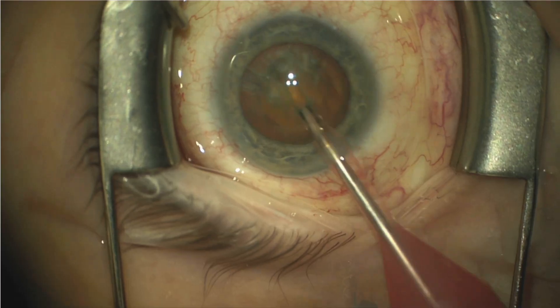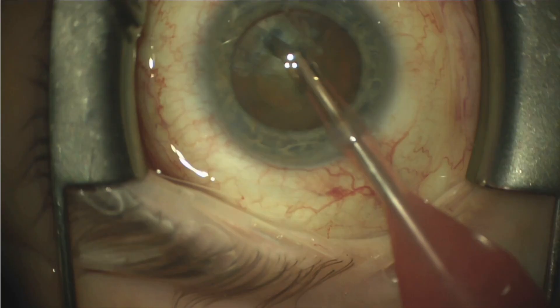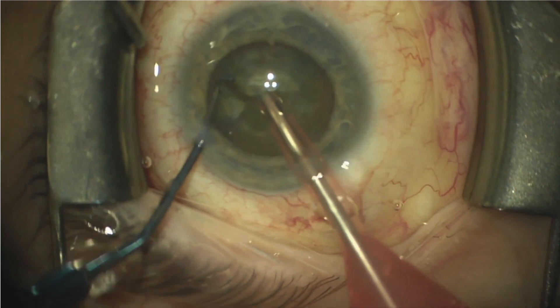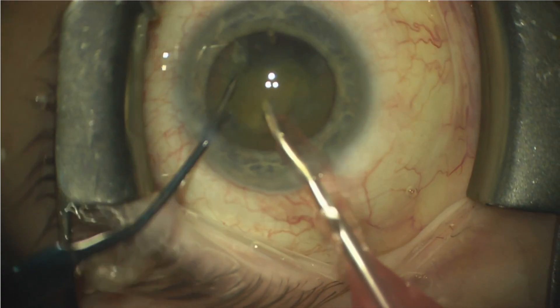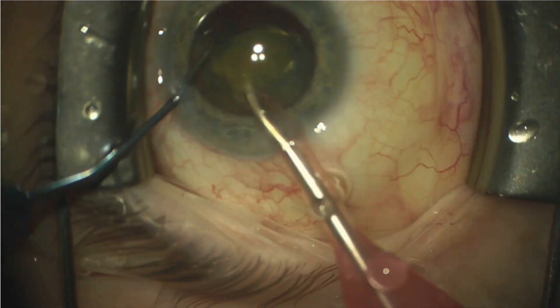This capsulorrhexis is about 3.5 to 4 mm in size. It's followed by hydrodissection and then a divide-and-conquer technique to remove the cataract. Since this is a smaller rhexis, there might be some difficulty removing the quadrants — I'm going to slow it down here to show you that. The first quadrant as it's coming out has to be redirected to the side and then brought above the anterior capsule.